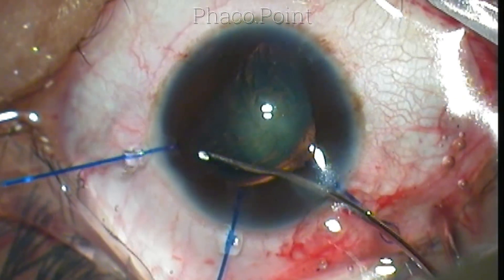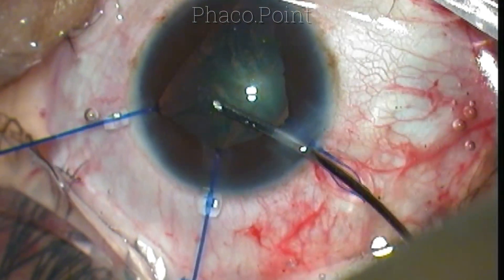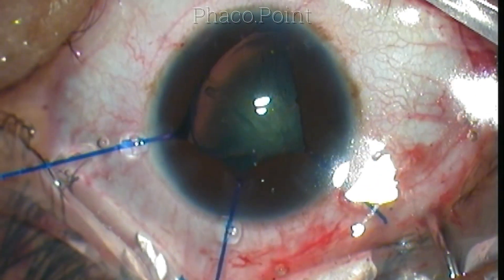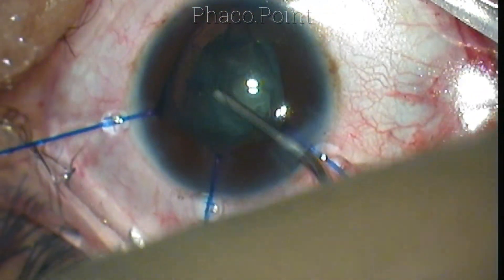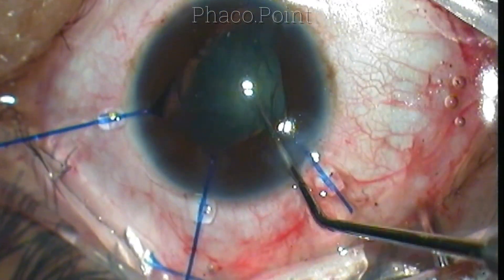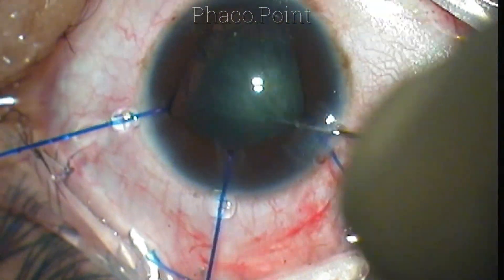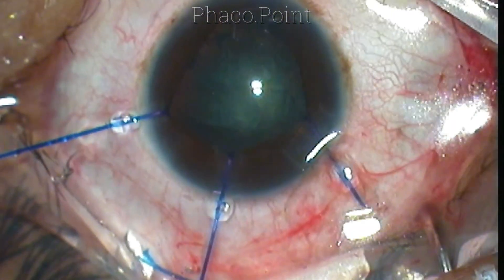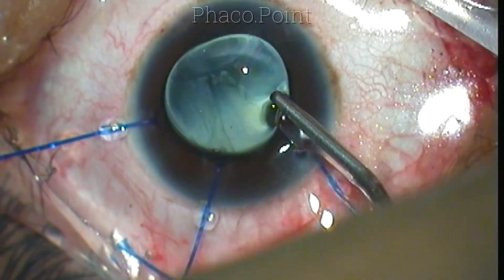During hydrodissection, the wave actually passes and causes the soft lens to pop out of the capsular bag. Because the chamber is very shallow, I do not want to do a tilt-and-chop maneuver or apply phaco power within the anterior chamber. I tried to manipulate the lens back into the bag but found it difficult due to trapped fluid between the capsular bag and the lens. I put in visco and tried my best to reposition the lens before proceeding with phacoemulsification.